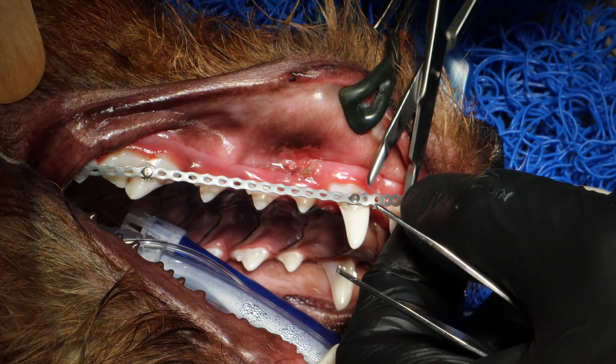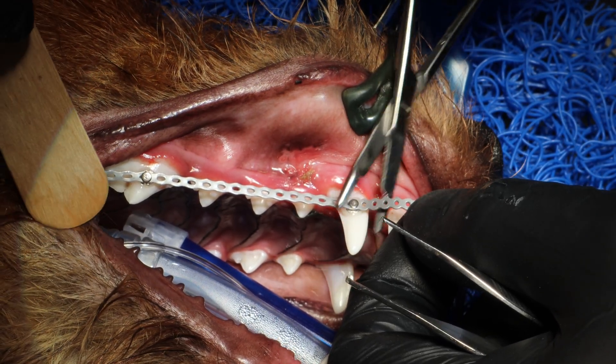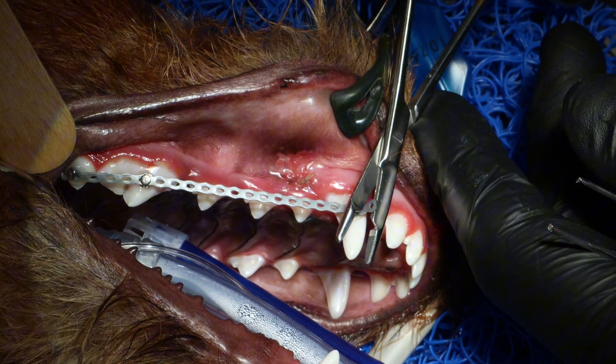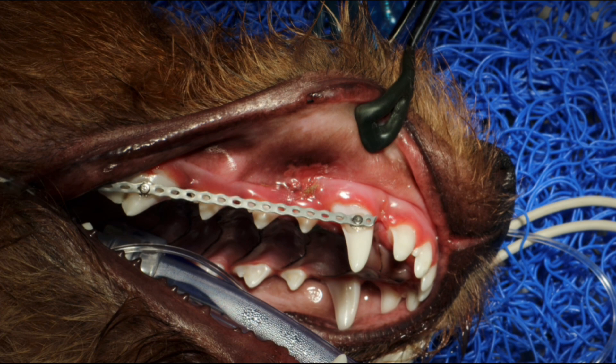What you want to do is induce a physiologic movement where there is resorption on the pressure side. When you push or pull a tooth, the periodontal ligaments will stretch or be compressed. On the compressed side there will be resorption of bone; on the stretched side there will be deposition of new bone. But if you compress or stretch too hard — with force greater than the capillary blood pressure in the periodontal ligaments — you will have necrosis, which is very bad. More force is not better. If you stretch the elastic band too hard you will get pathological tooth movement through necrosis, and there will not be adequate bone deposition on the correct side.